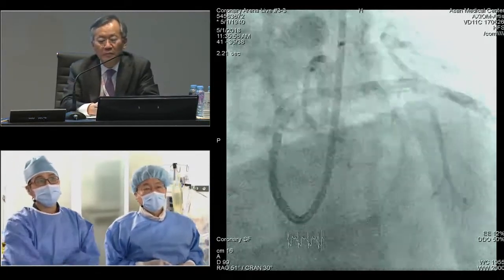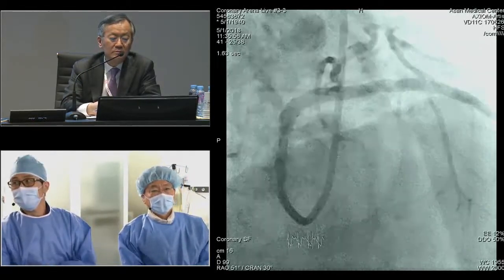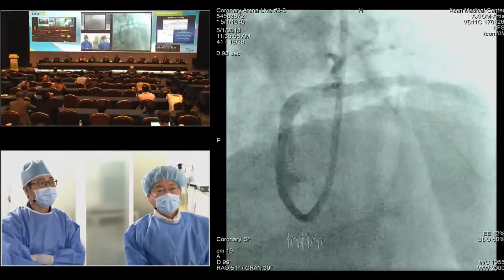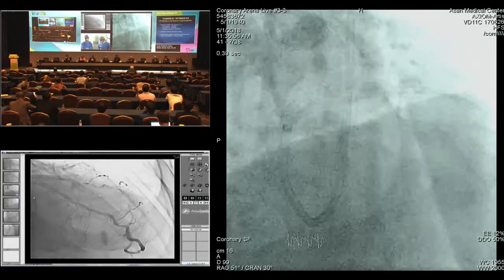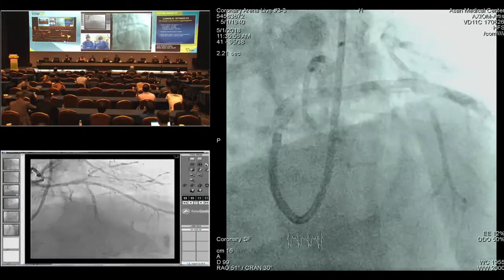All right. Opposite to the septal, originally they have 2 millimeters in size of ostial stenosis. So it's a sizable territory also. So the question is, do you like to rescue that diagonal or not? Is the patient symptomatic or not?